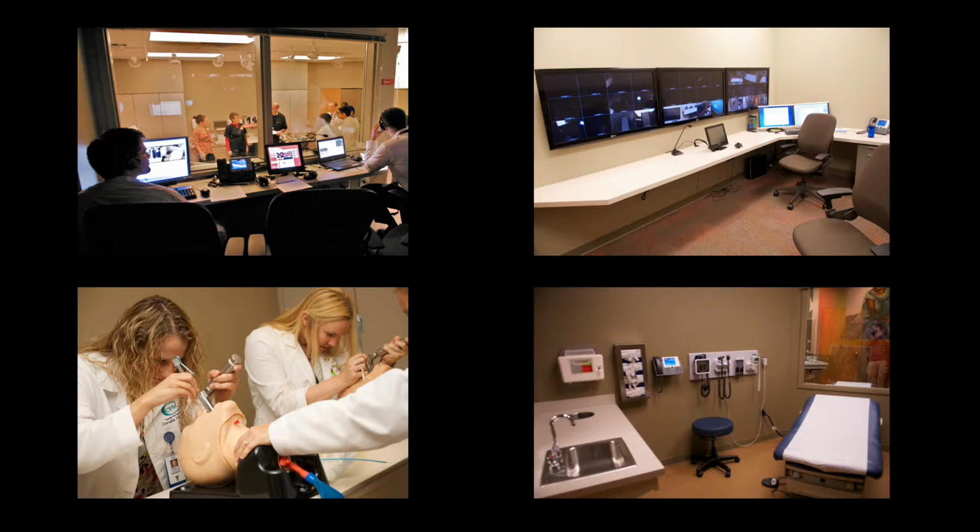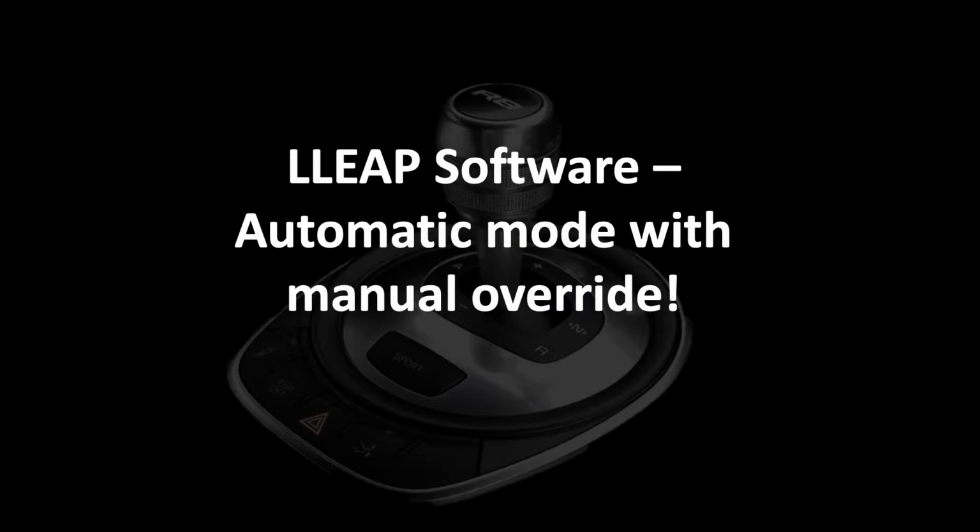When we started creating our own scenarios, we dug into the software a little deeper and found that it is quite flexible and that we could use it to our advantage. We realized that we were spending a lot of time programming our scenarios and that we had to come up with a more efficient way to make this happen.